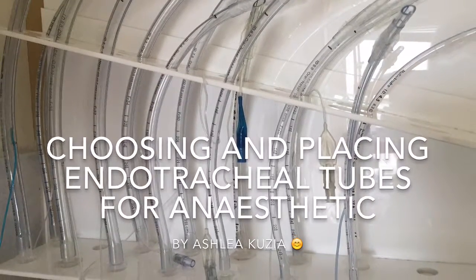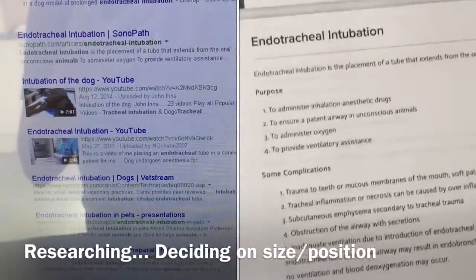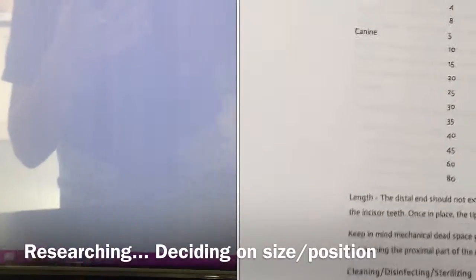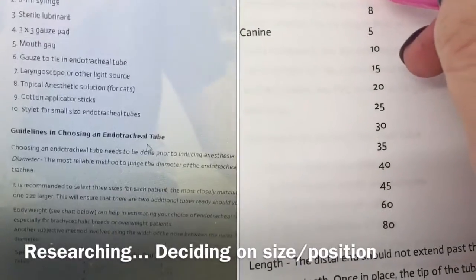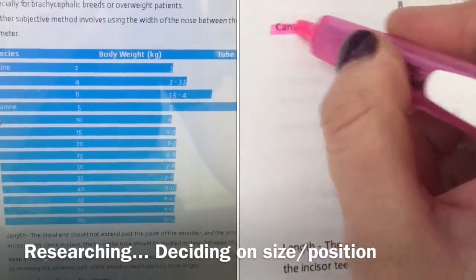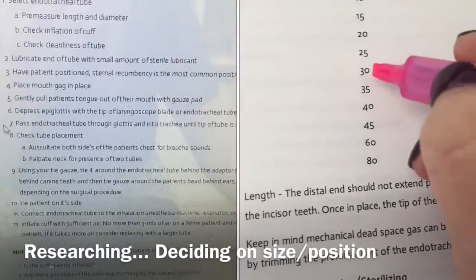I decided to learn the correct way to choose and insert endotracheal tubes. I began by Googling endotracheal tubes in pets and was able to find a great deal of information on my first search via the Sonopath website. After reading about the purpose and possible complications, I found a size chart which I printed out and began highlighting with the pets that we had in the hospital at that point.